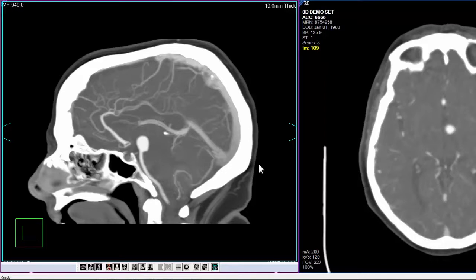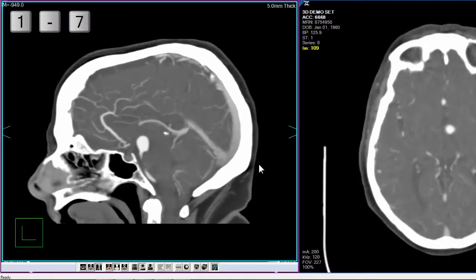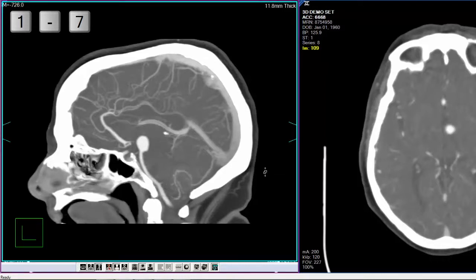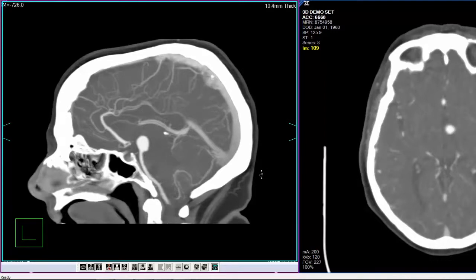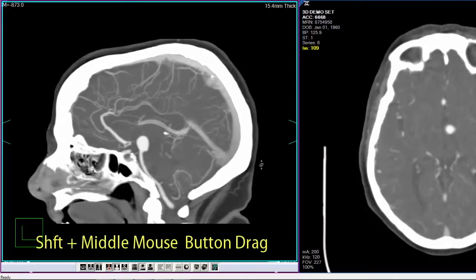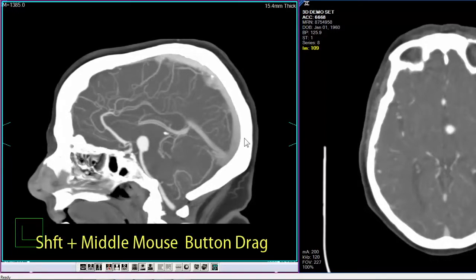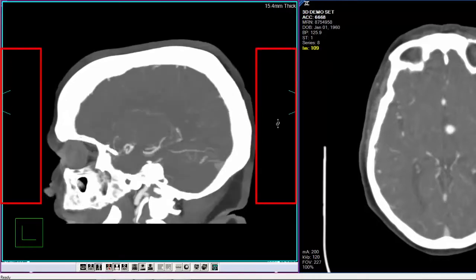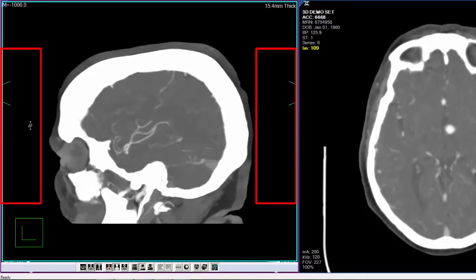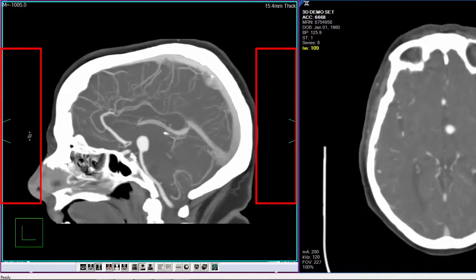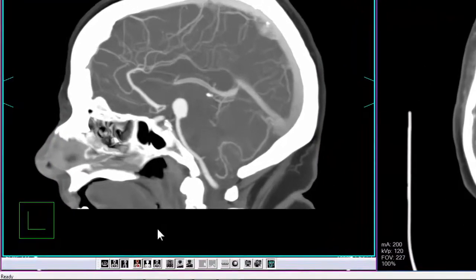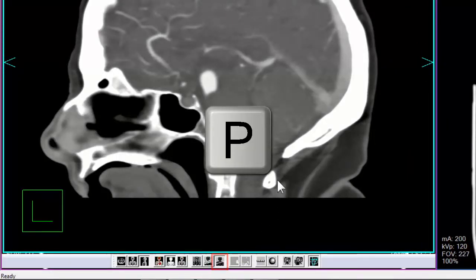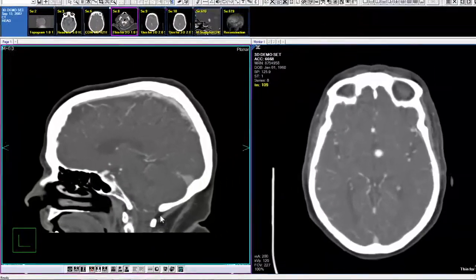This is the thick slab reconstruction icon; its keyboard shortcut is the letter T. Thick slab reconstructs the data using the defined slab thickness. Slab thickness can be changed with keyboard shortcuts — top row number keys 1 through 7 can change slab thickness from 1 to 20mm. To define a custom slab thickness, hold Shift and drag the middle mouse button. To scroll through the stacked volume, use your mouse wheel or left-click and drag along the lateral borders of the image frame. This is the planar reconstruction icon; its keyboard shortcut is the letter P. The planar mode reconstructs the data as a two-dimensional planar image.